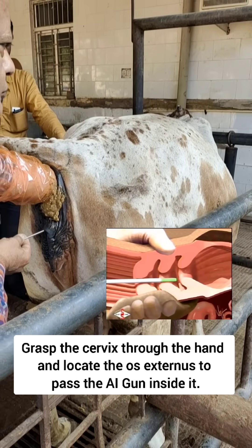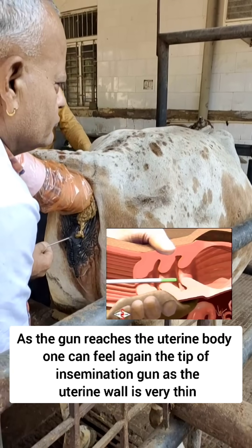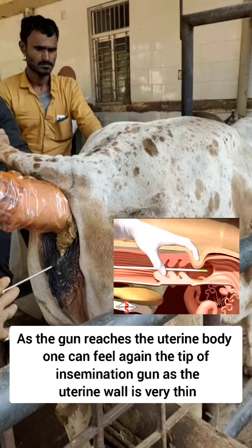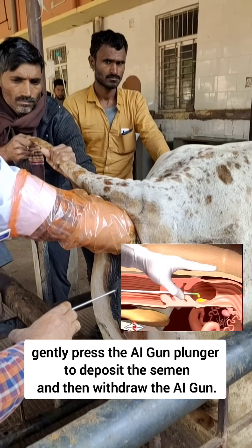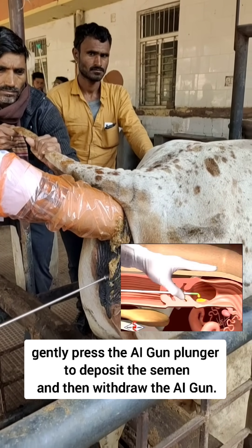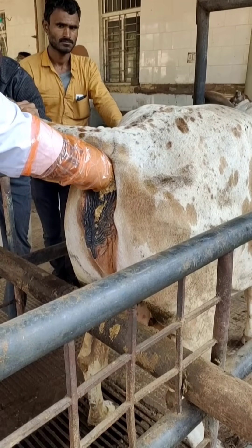Once it has passed inside the os externus, gently manipulate the cervix through your hand, and when it is inside the uterine body, just push the plunger of the AI gun to deposit the semen. Then take out the AI gun and your insemination is complete.